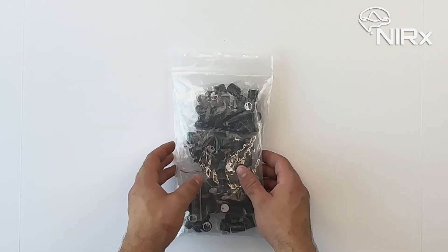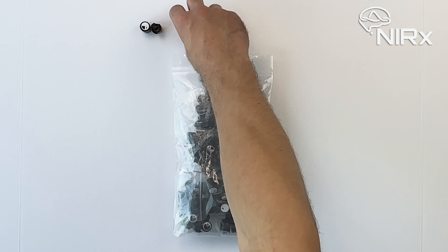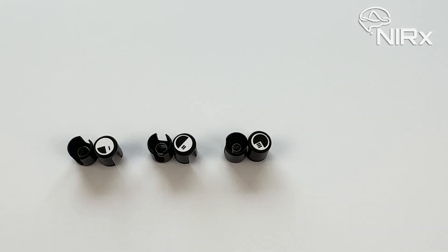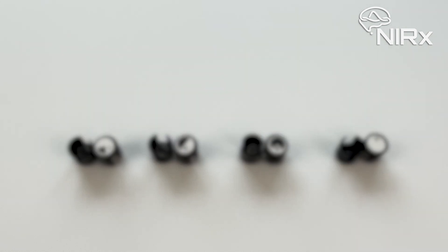Locate the package of spring tops sent to you by Nirex. Each spring top is labeled on the top with its spring tension, ranging from 1 to 3. These markings indicate the level of downward force applied by the spring inside the cap to the optode, with 3 being the highest and 1 being the lowest. There are also spring tops with no spring inside, which are marked with a 0 on top, and these can be used over areas without hair.